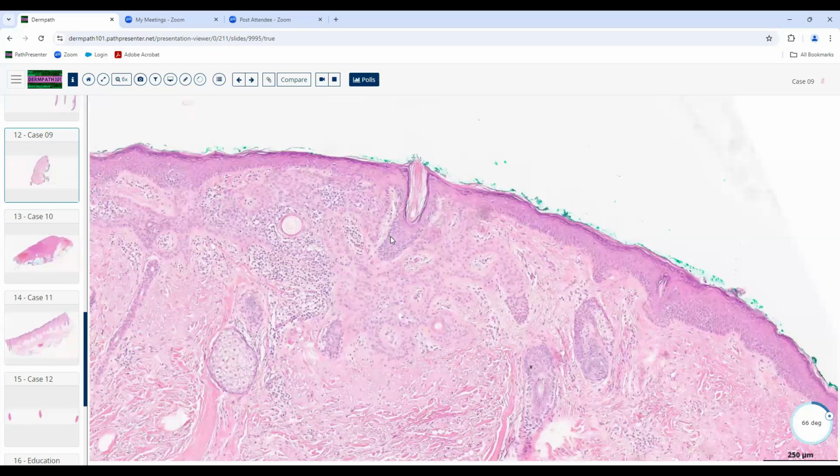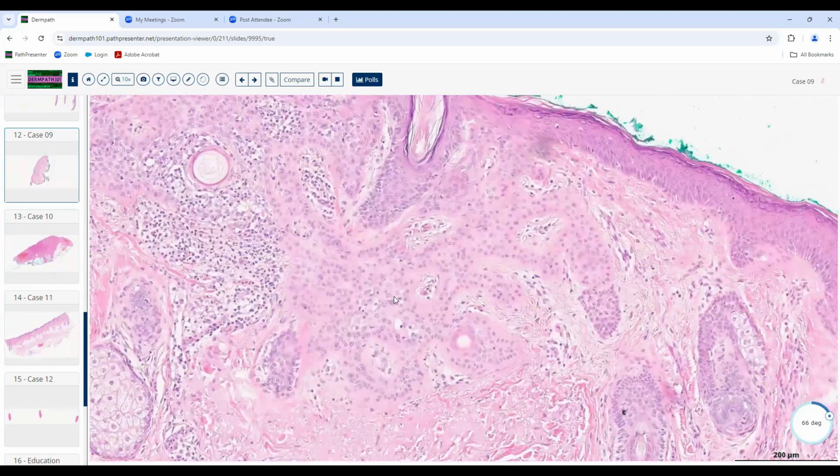Those cells are pluripotential, and they can do a lot of different things. They can form sebaceous glands, they can form apocrine glands, and when the follicle cycles, they can reform the new inferior portion of the follicle that comes back after the follicle goes through catagen and telogen. They can sometimes form hamartomas. And in this case, you can see it form this little curious hamartomatous process here.